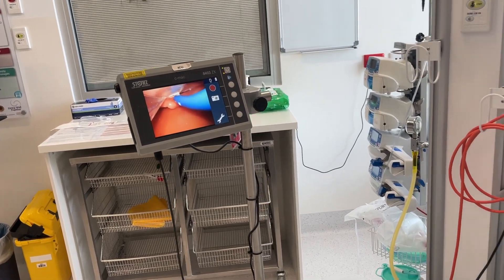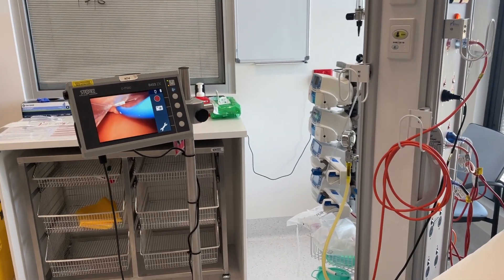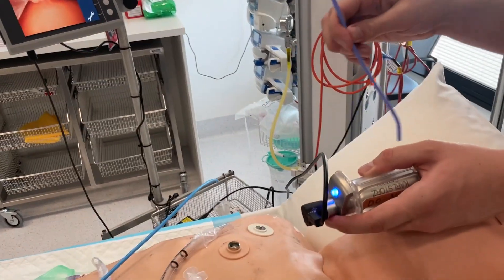With some of these bougies, these micro skills don't work. Here, simulating an anterior view, the Frova goes straight in. The coude tip is helpful, but the stiffness of the catheter and your ability to manipulate it are equally important.